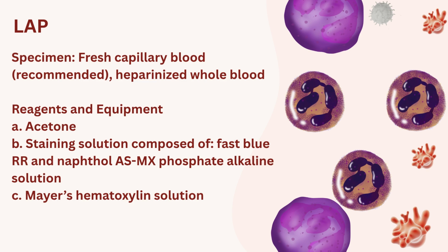So the specimen used is fresh capillary blood, or heparinized whole blood may also be used. Reagents and equipment are listed.